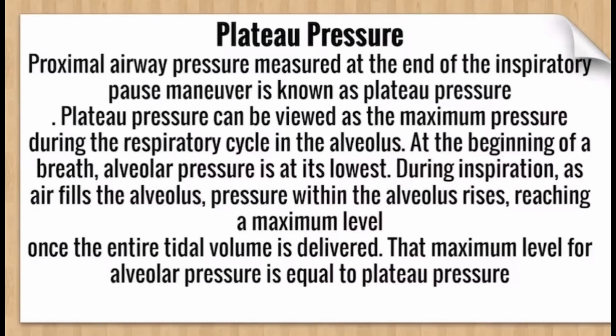During inspiration, as air fills the alveolus, pressure within the alveolus rises and reaches a maximum level once the entire tidal volume is delivered. That maximum level of alveolar pressure is equal to the plateau pressure.